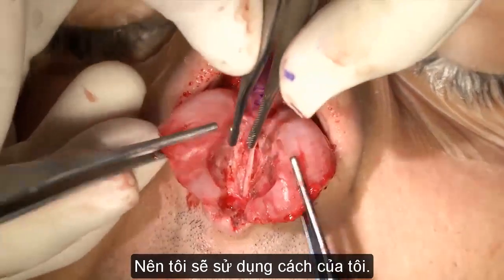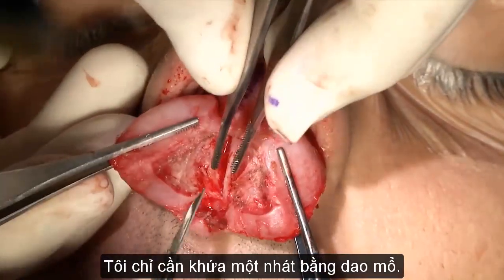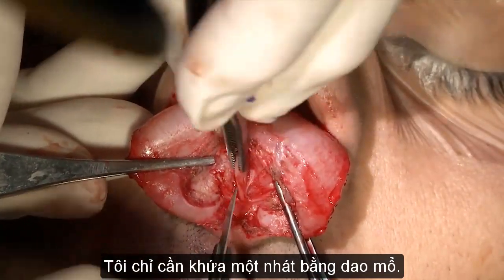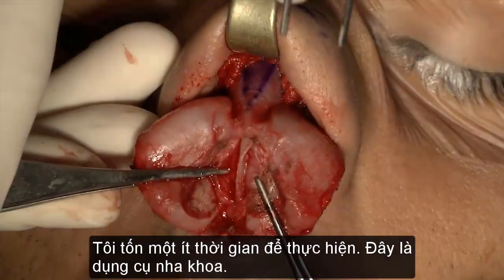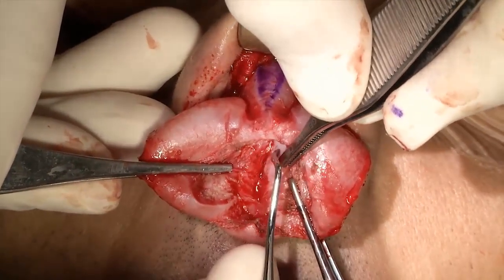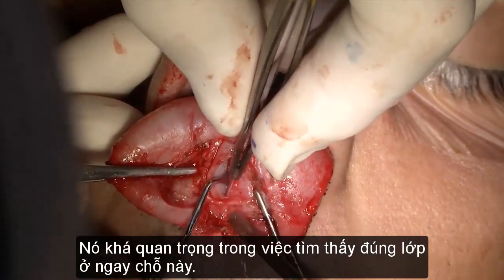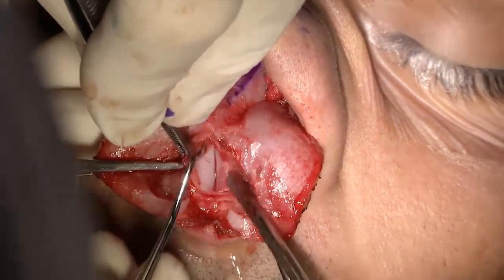Dammi la lama, quello mio. Piano. I just need a minute touch with my blade. And I take a little bit of time. This is again a dental thing. So it's so crucial to find the exact plane here.